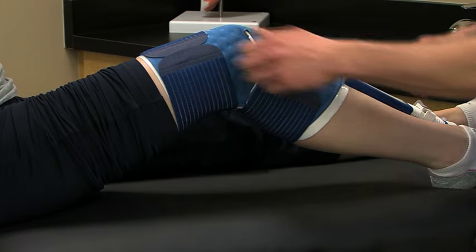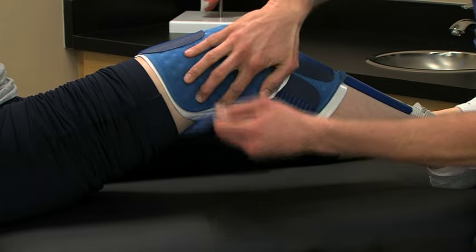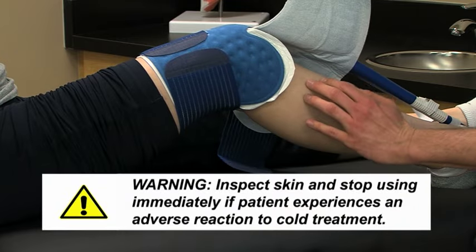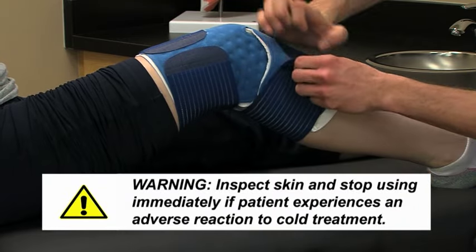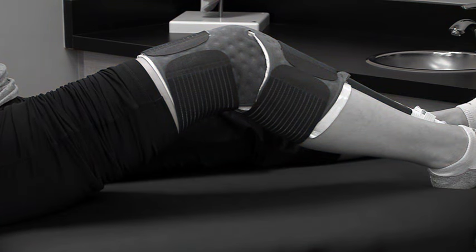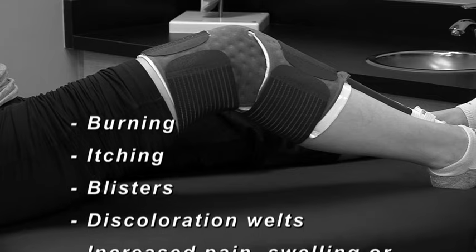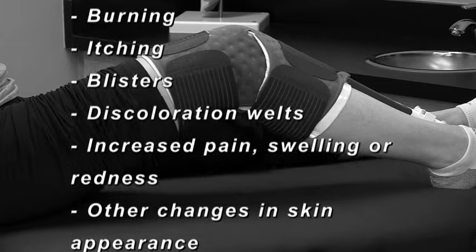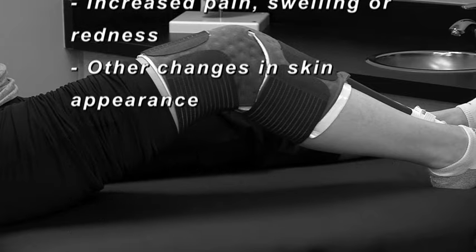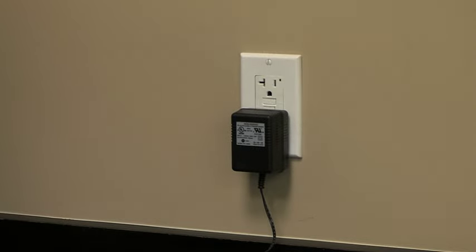Be sure to inspect the patient's skin under the pad as prescribed, typically every one to two hours. You should be able to inspect the skin by lifting the pad and insulation barrier. Discontinue use and contact the physician if your patient experiences any adverse reactions such as burning, itching, blisters, discoloration, welts, increased pain, swelling or redness, other changes in skin appearance, or any other reactions that have been discussed with the physician.